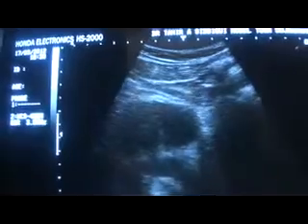This is a case study regarding the male urinary bladder. This is the urinary bladder in transverse section. This is the outer wall, and the outer wall is not thick.